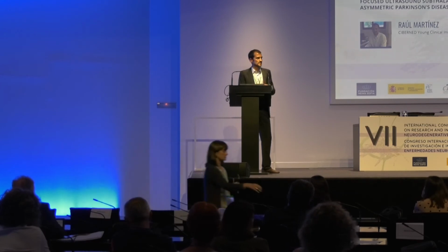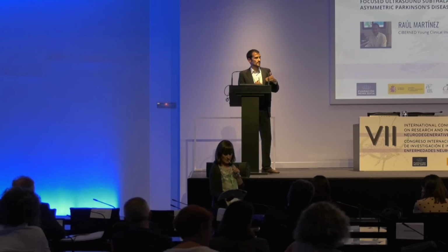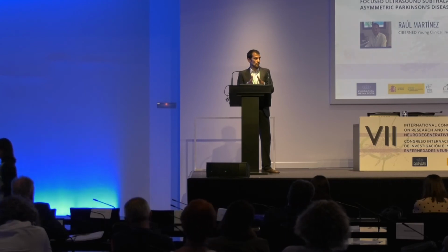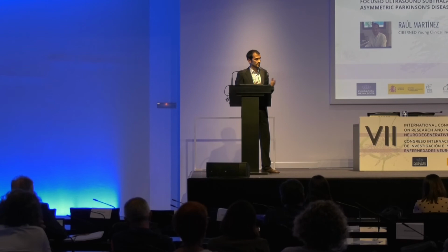You can test with low power sonications, with low temperature, whether there is a therapeutic effect or a side effect. If there is a side effect, you can move your target accordingly, because the side effects in the STN are usually localizing, as with deep brain stimulation. So it's true, we don't have electrophysiology, but we have other safety measures. With DBS, many people operate without electrophysiology today.